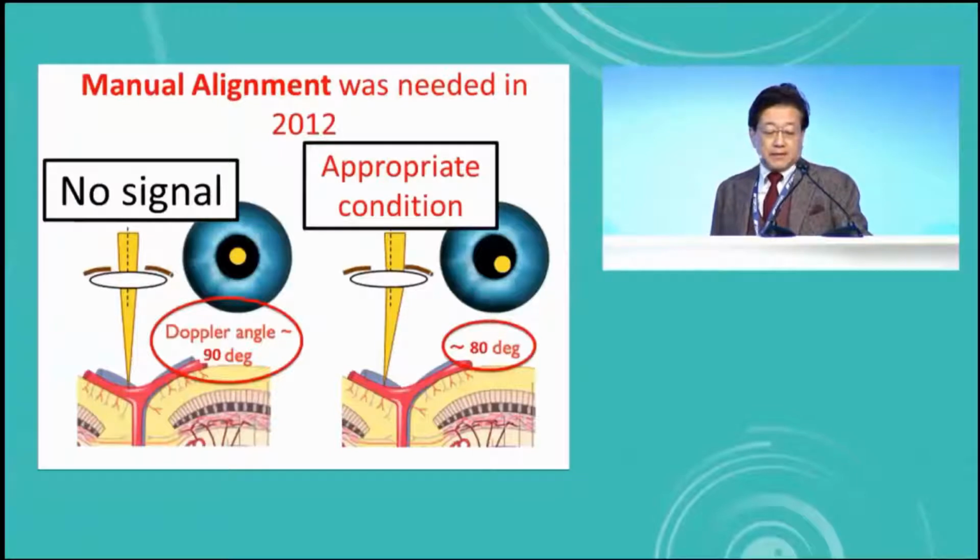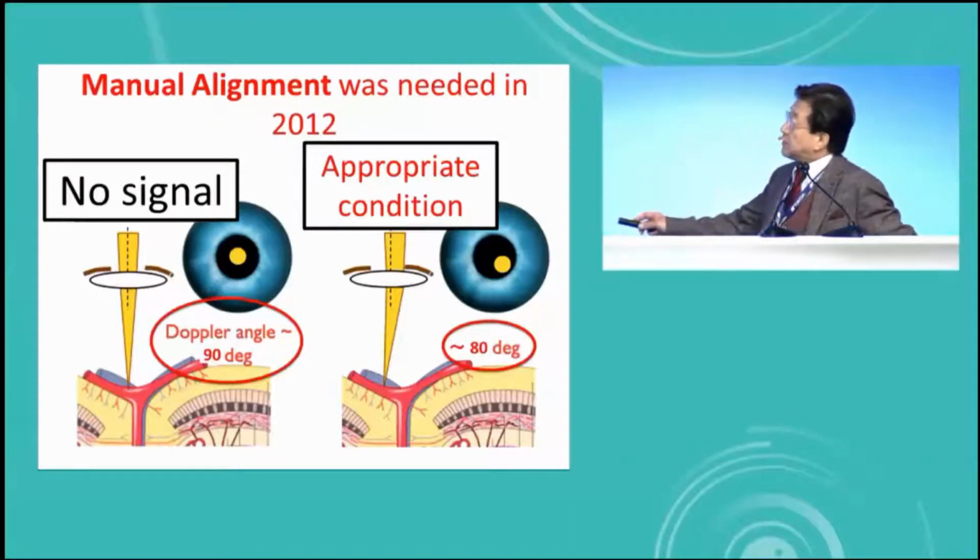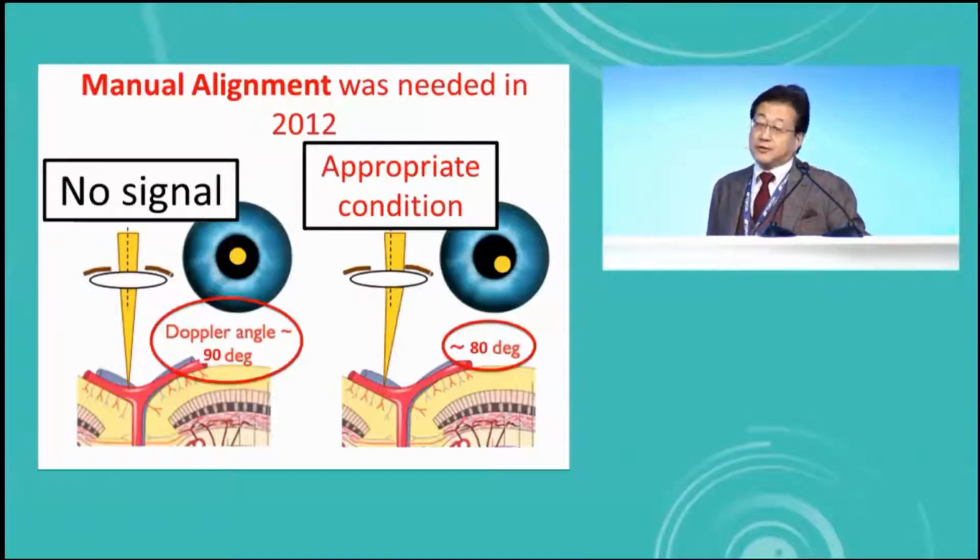Now, talking about 2012, manual alignment was needed in this technique.